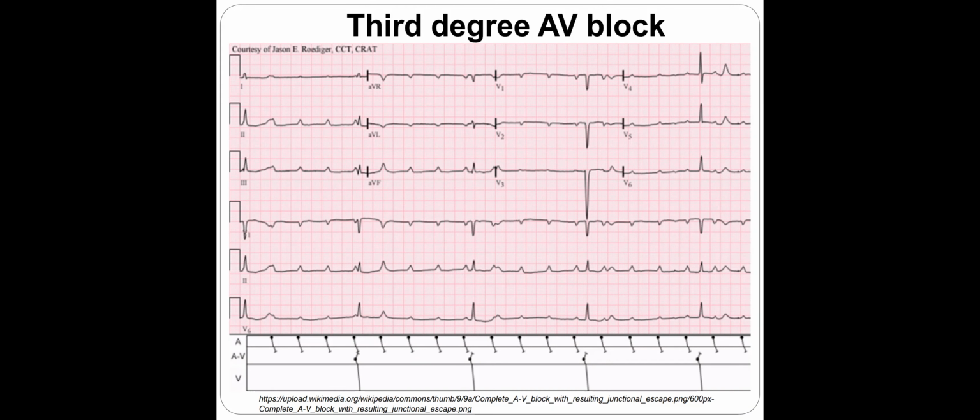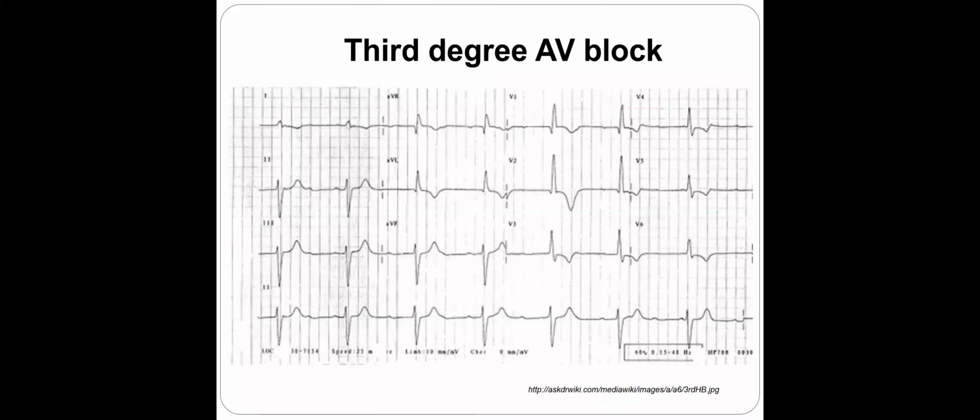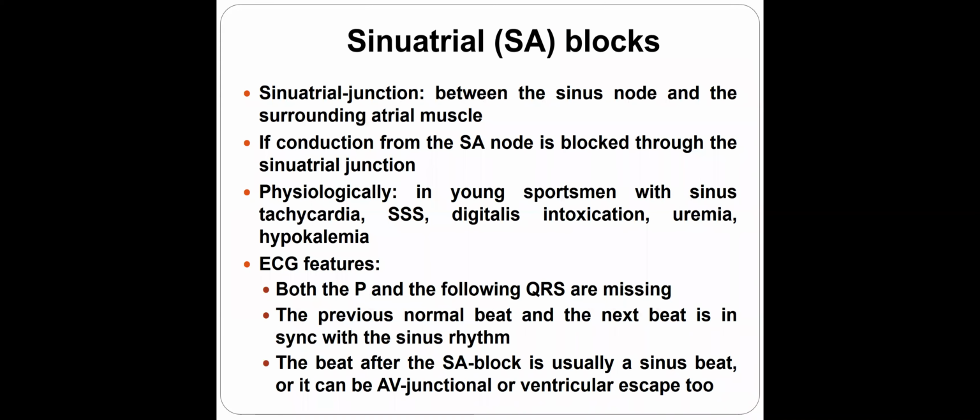Okay, good. Let's move on. This is very similar, but here we do have a little bit wider QRS complex. Okay, SA blocks. Now that's a little bit difficult to understand. But let's look at when we had AV block.